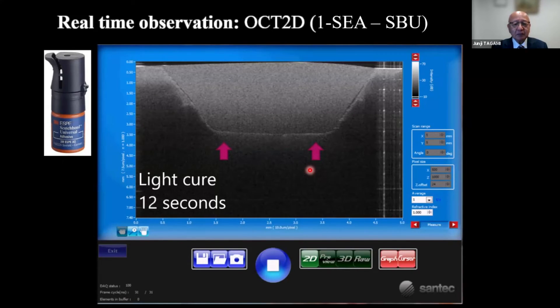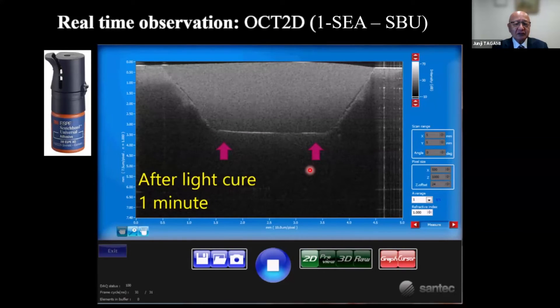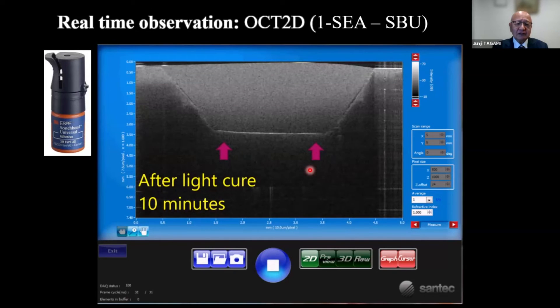At this part you can see the gap has started. During light curing, the bond separation has already started at the bottom of the cavity. Even after the light radiation stopped, the shrinkage stress remained in the bulk of the composite — that's why the gap continued to extend.